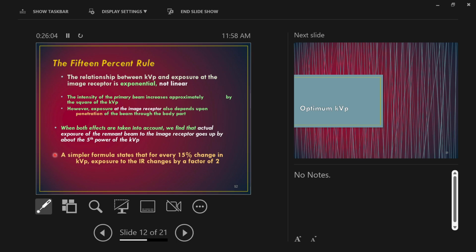So, option 2 for patient 2 is 69 kVp at 10 mAs. All 3 of these are going to give us the same exposure at the image receptor. Meaning all 3 ways to do this, thin patient at that setting or thick patient with those 2 options, are going to give us 3 different images with equal brightness density. Okay?